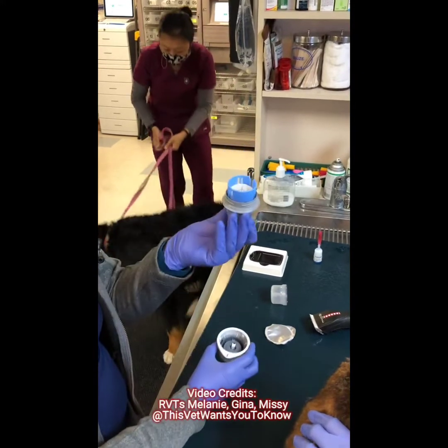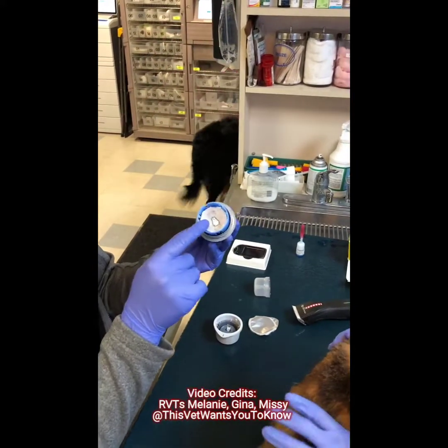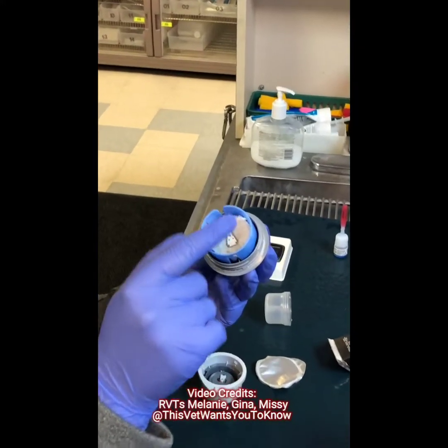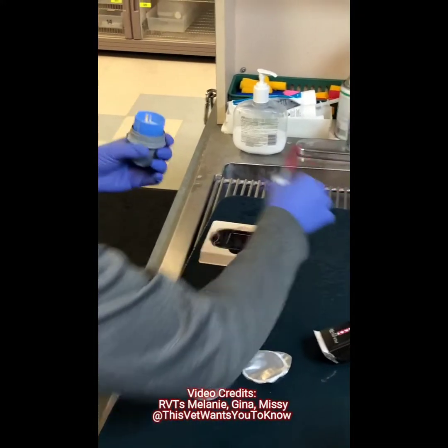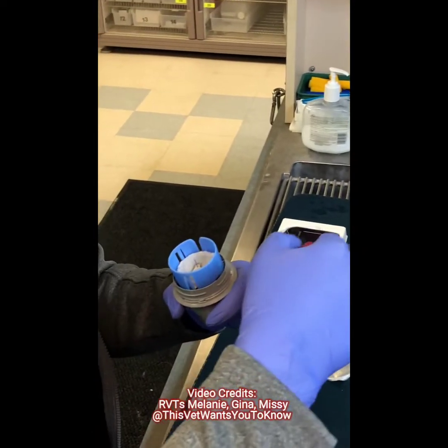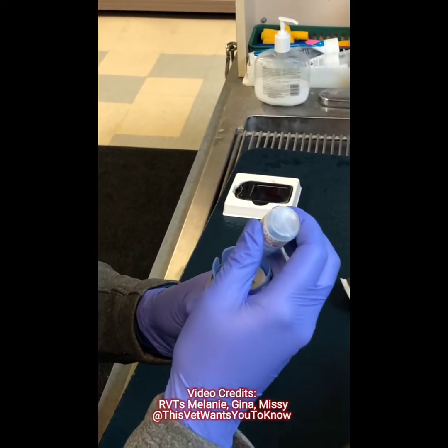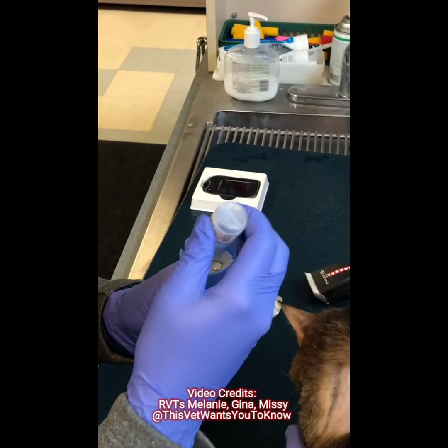It becomes one piece. This is the part that's going to go under her neck. I'm just going to put a couple drops of tissue glue to help it stick, but you do want to make sure it's something safe for the skin — not regular super glue or anything like that. So I'm just going to do maybe two drops.